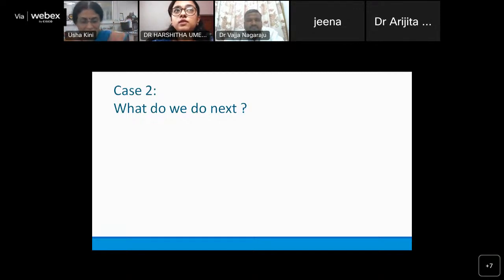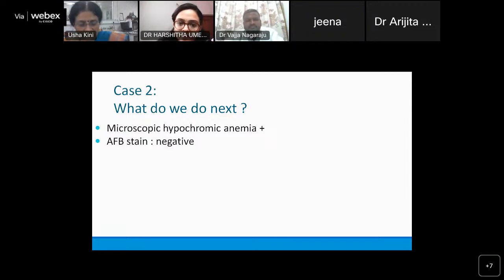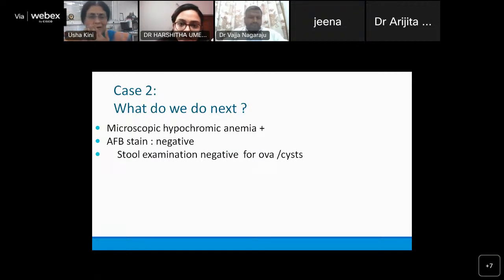Tuberculosis. Anything? Ma'am, for my diagnosis, I want to rule out with serology, ma'am. Yeah, serology. Okay, the child had a severe microcytic hypochromic anemia. But to answer your question, you wanted to know ZN, it was negative. Stool examination was negative for ova and cyst, because I'm trying to show what all was being worked on in the case. I'm just showing it to you.